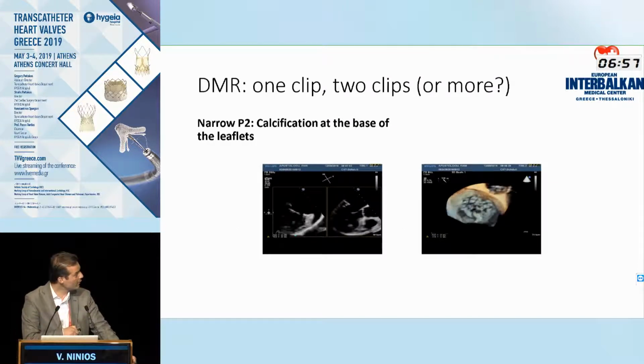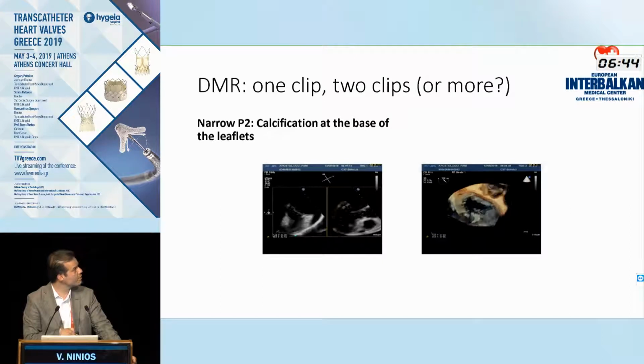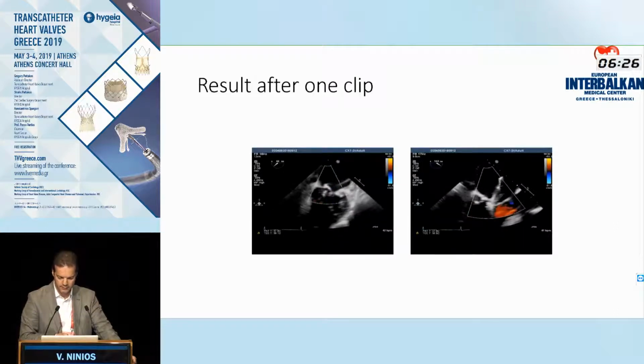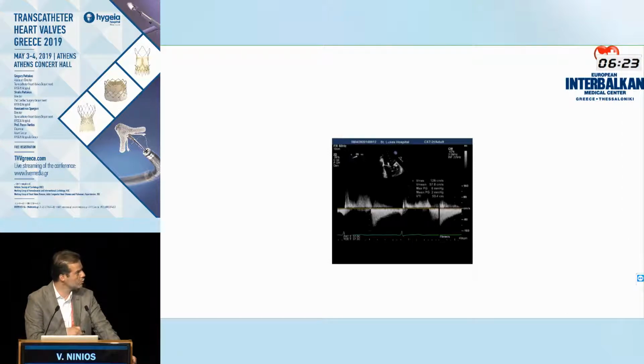Look at this situation. This is a narrow scallop of a flail P2 there, with some basal annular calcification. Actually, the calcium you can see. So this is the reason. This is an 86, I think, year-old female patient, and you know, high risk for surgery. So we thought, okay, we have one shot here. We have to put the clip straight where the flail part is. And this is what we did, and this is an acceptable result, as you can see, with almost no mitral regurgitation with a mean gradient of 2.